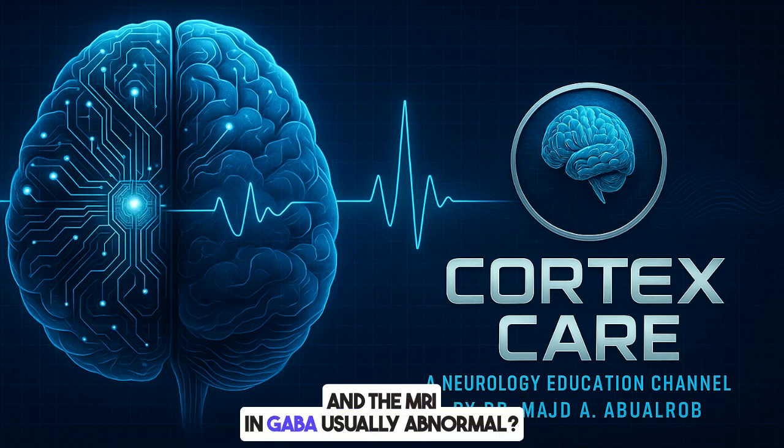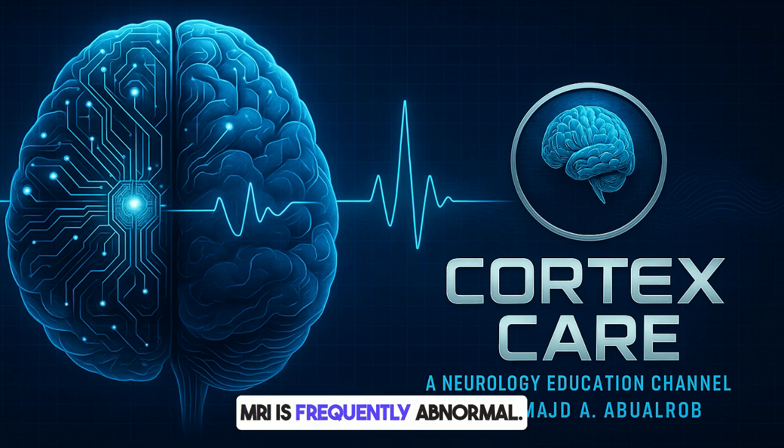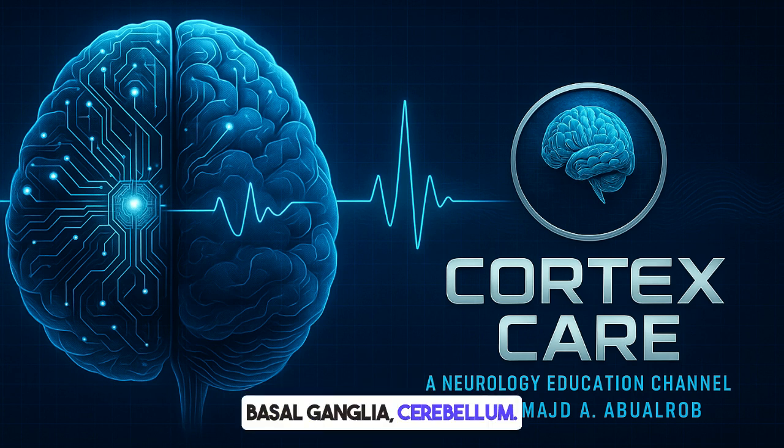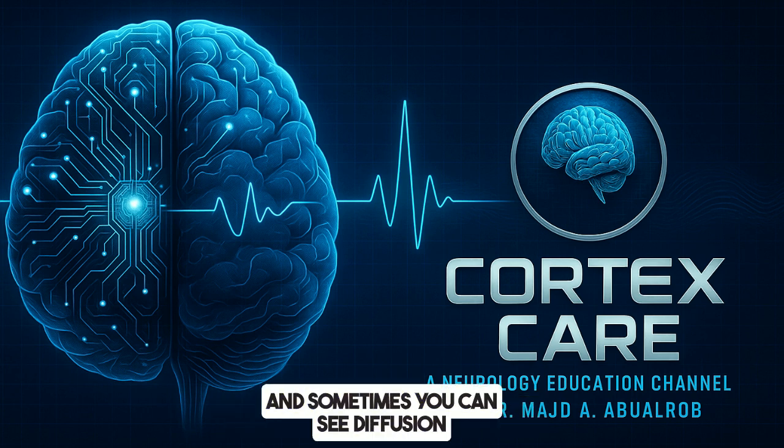And the MRI in GABA A? Usually abnormal. Yes, MRI is frequently abnormal here. The typical pattern is quite different from the others we've discussed. How so? It's often multifocal, confluent T2-FLAIR hyperintensities, widespread bright areas merging together, but involving both cortical and subcortical regions pretty extensively. Which regions specifically? Medial temporal lobes can be involved, but also orbitofrontal cortex, parietal and occipital lobes towards the back, the insula deep inside, basal ganglia, cerebellum. It's often described as cortico-subcortical lesions, quite widespread. Okay, so a more diffuse pattern. Generally, yes. And sometimes you can see diffusion restriction in those areas too.